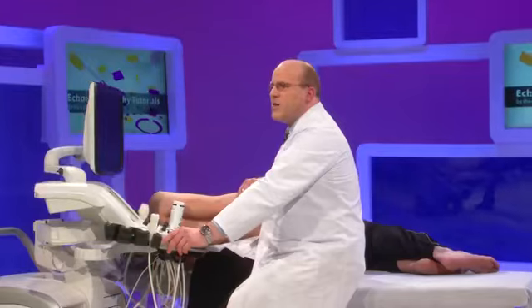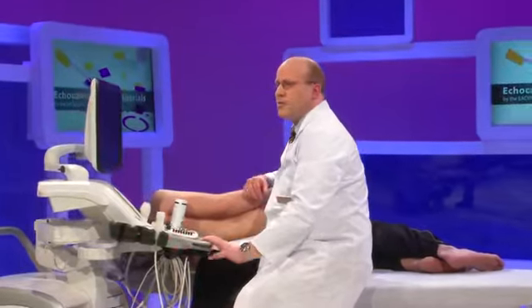In the following, I would like to show you how to quantify myocardial function. We have two methods to do so, tissue Doppler imaging and speckle tracking. I would like to guide you through these two methods and show you some details of data acquisition. The most important thing, since we are talking about quantitative function, is that we have good images, good image loops, and we need several image loops to evaluate the function of the ventricle.